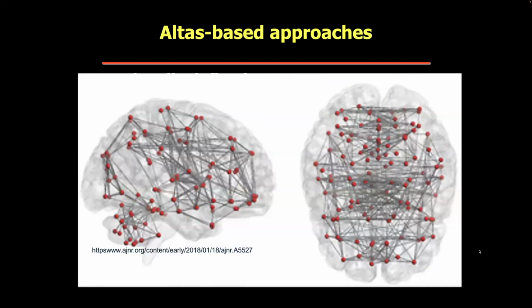And then what you would do is look at the connectivity across all of the regions and create these connectivity maps. And again, the way these are links or edges, connections between the nodes or the regions in the brain, those edges or those connections are weighted. So some of them are lighter and some of them are darker. So the darker would be a stronger connection. And that connection is really just based on, are those two signals, the bold signal time series, are they similar? Or if they're different, for example, this node here, some of the nodes you can look at and see there's no connection between them, which means that the signals are quite different. So those two nodes aren't directly connected.